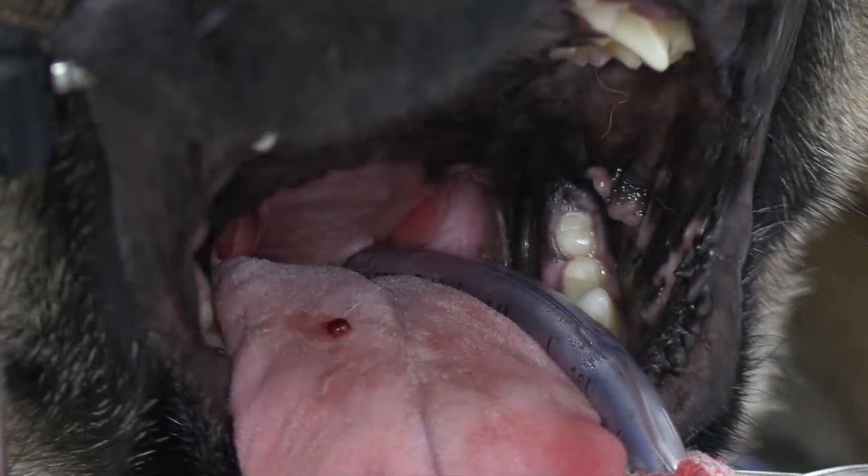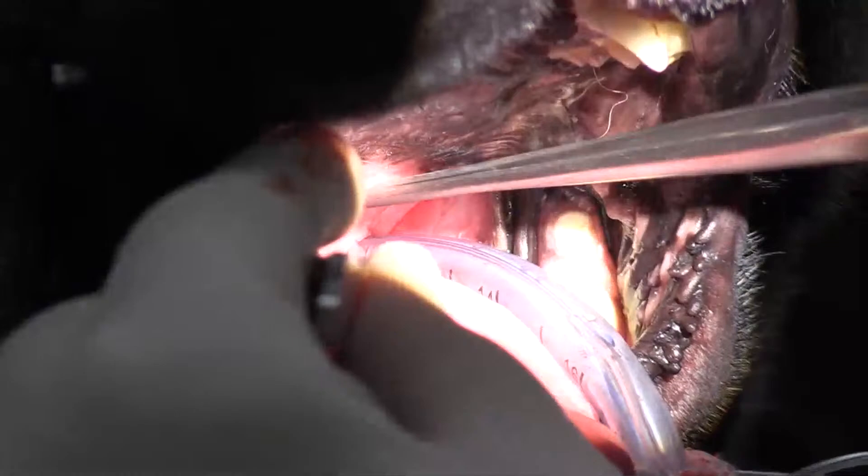The folded flap palatoplasty — what we're doing is we're taking out the meat of the soft palate. Not only are we shortening it, but we're also decreasing the thickness.